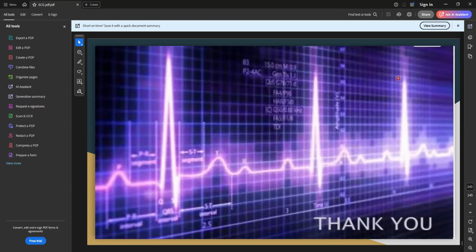You have to consider those leads and suspect whether the patient is in the early phase of myocardial infarction or has already entered the myocardial infarction state. Everything you have to monitor.